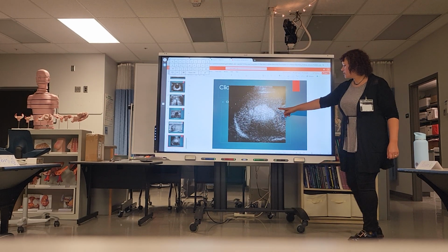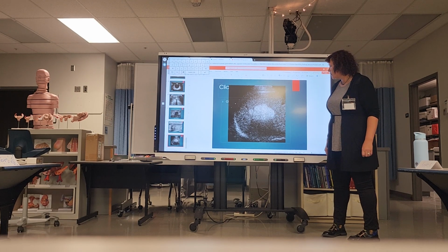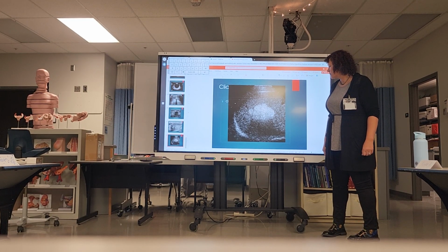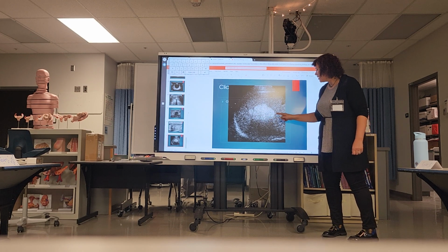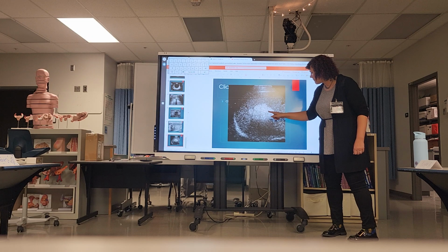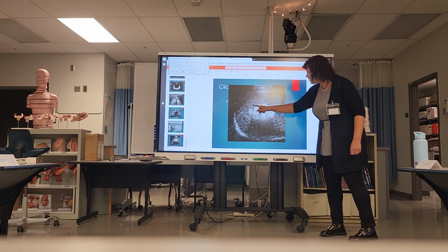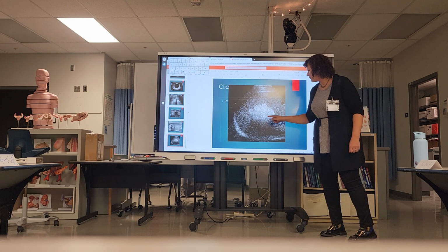All right, what's the echogenicity here? Hyperechoic or echogenic. And what about the borders? Irregular. Yeah, irregular, lobulated. We can put calipers there. We can definitely tell where the normal tissue is versus the mass, but it's not beautifully round and well circumscribed. It's definitely irregular and lobulated.